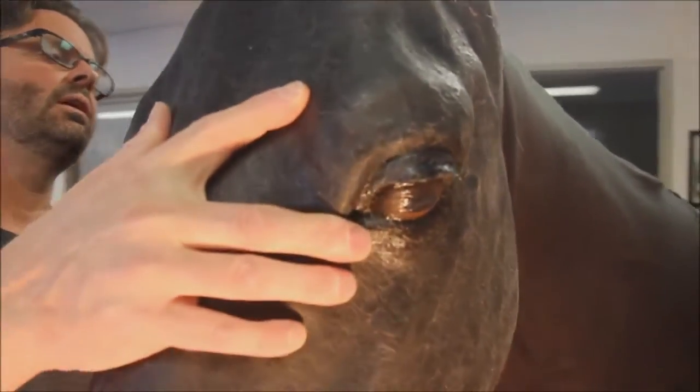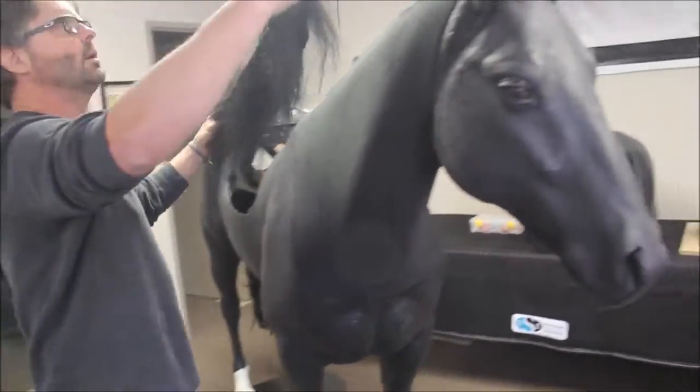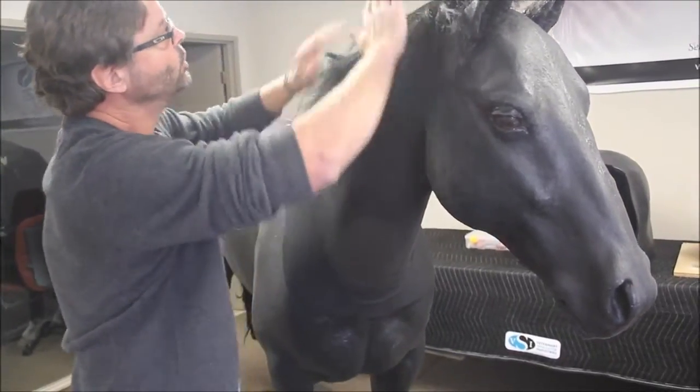The head uses the same attachment type as the neck and simply slides onto the receiver in the neck. The horse also features an open mouth for applying a bridle. The neck hide or covering is a piece of fabric that slides over the neck to cover the veins and intramuscular pads. The mane is simply attached with velcro.